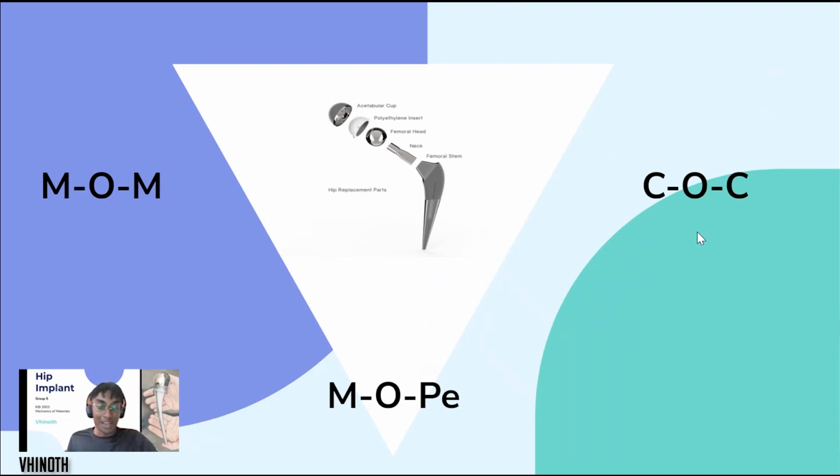When discussing manufacturing, it is necessary to take account of popular types of hip implant. First being metal on polyethylene, M on PE hip implant. The bearing is highly popular, and what is so attractive about this type of bearing is its safe, predictable and cost-effective aspect. Unfortunately, the M on PE does come with issues such as implant failure due to PE debris, which causes periprosthetic osteolysis through the secretion of proteolytic enzymes and cytokines.